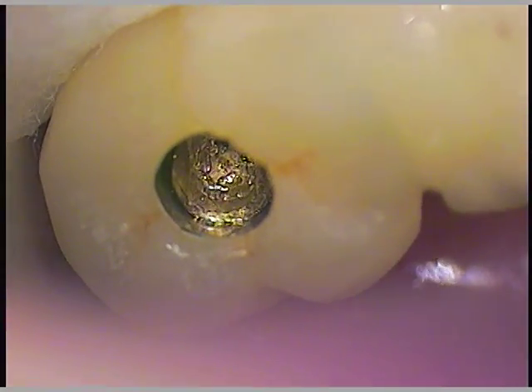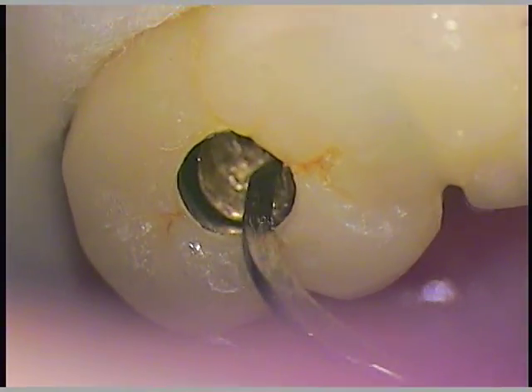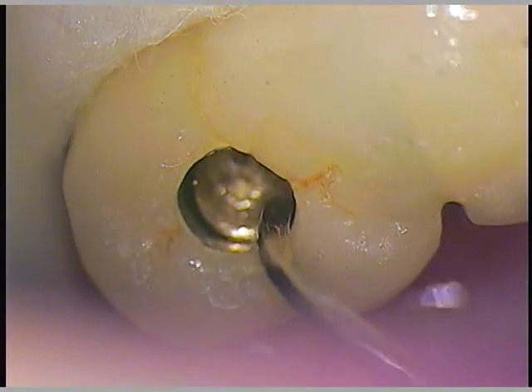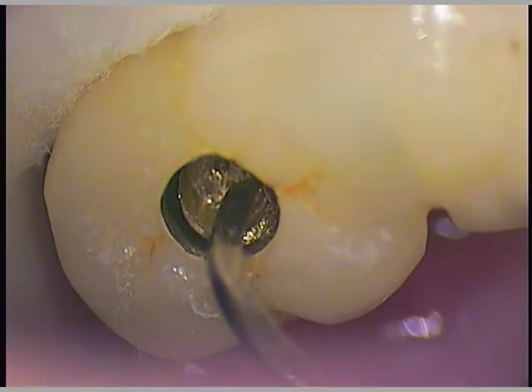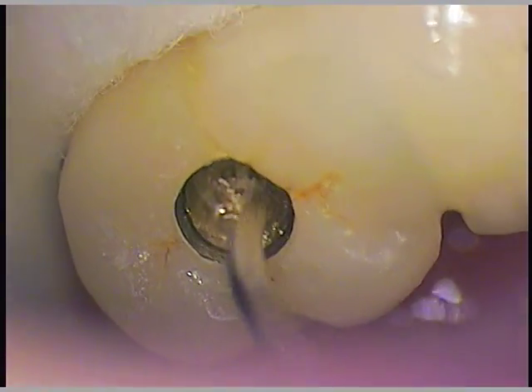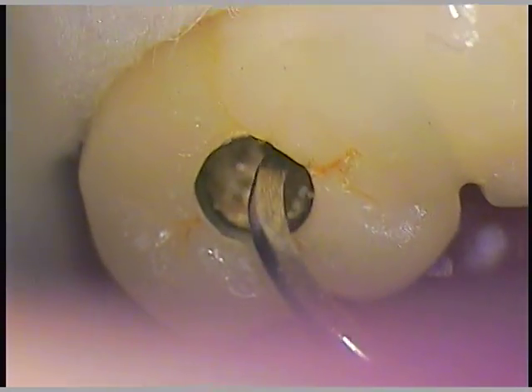There's our screw. It's a gold-tight screw. Somebody asked me about that — I'm used to seeing titanium without a gold, but this one's got a gold-tight. It's soft. Extremely soft. That's what makes it so hard to tighten, because it's soft at the screw head.